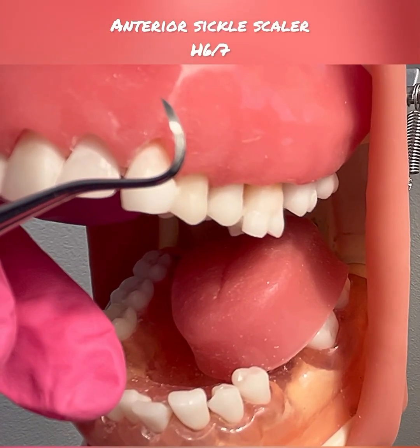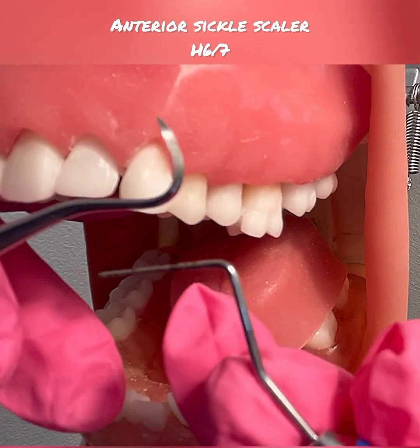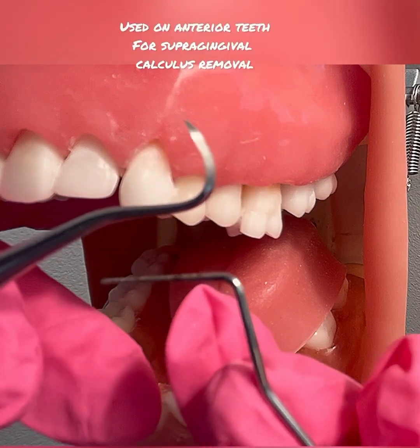I will be demonstrating the anterior sickle scaler, which is the H67. This instrument is only used on anterior teeth, staying supragingively.